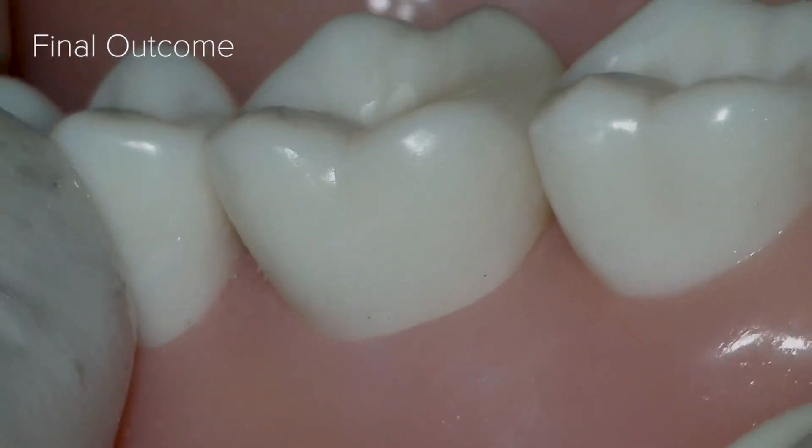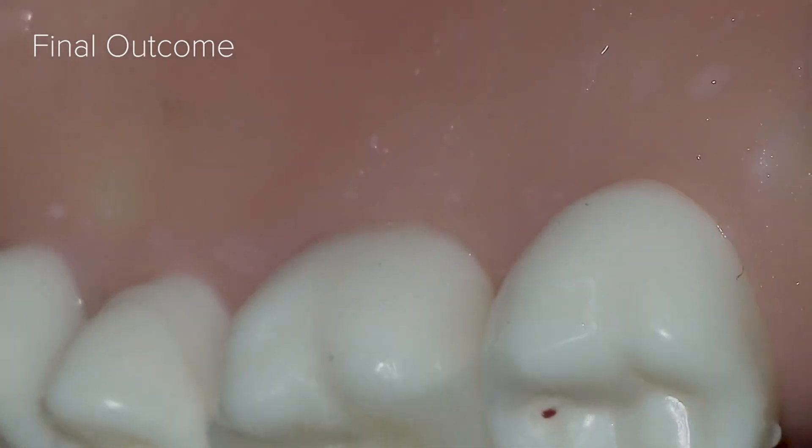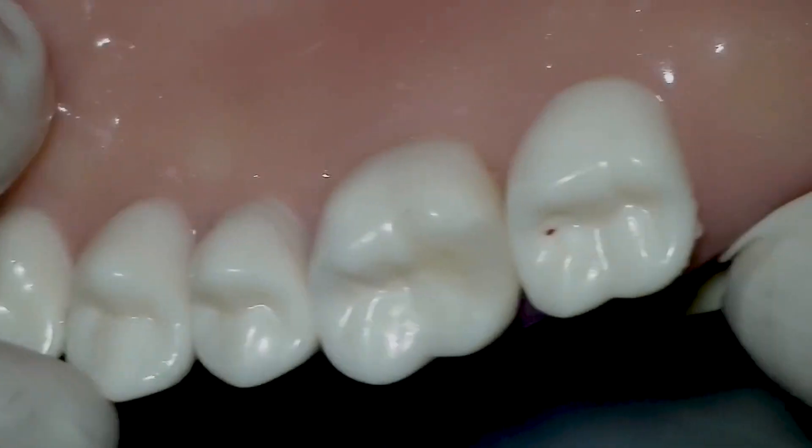The Bioclear Class 2 is a welcomed update of the traditional Class 2. It is both aesthetically and radiographically beautiful, smooth to the patient's tongue, and comfortable in function.